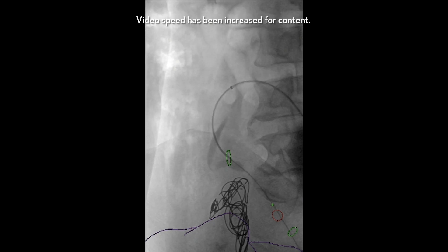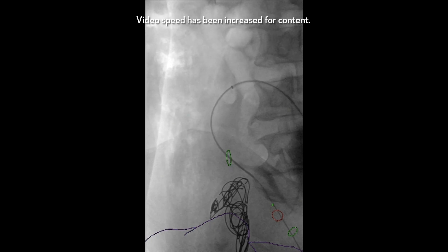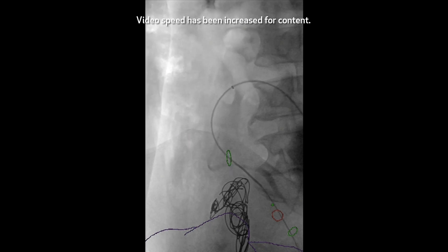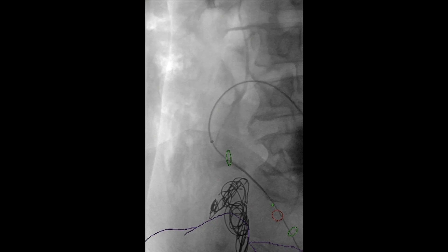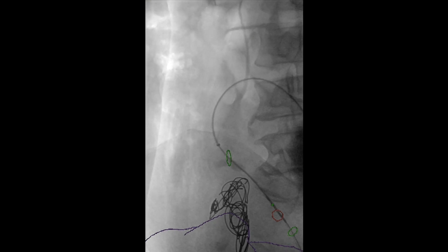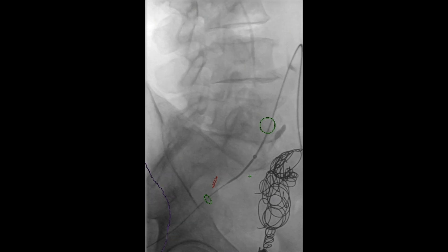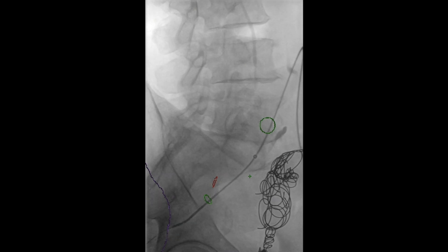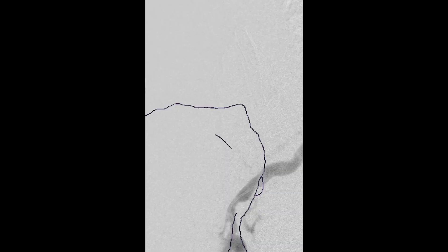Some of these embolization pictures are sped up for content purposes — this is not the speed at which to deploy coils or inject onyx. The green-red marks are fused images which show us the origin of the internal iliac artery and the origins of the branches, which we selected off the fused CT scan image to allow us to actually target them.